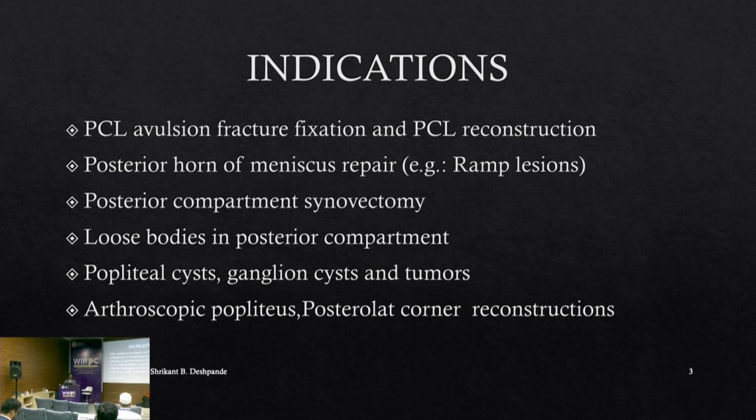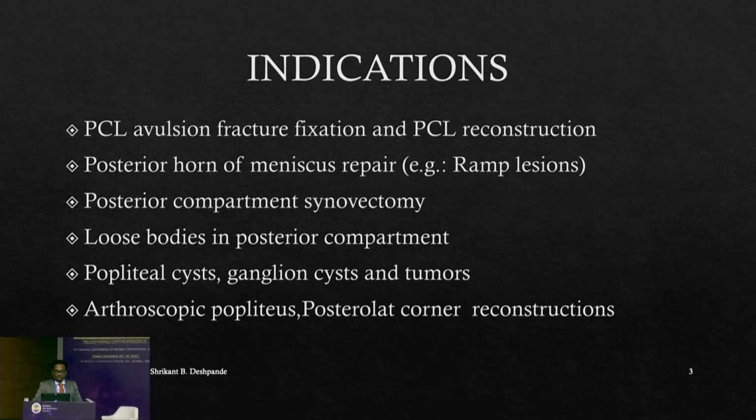The indications for the posterior portals in orthopedics are PCL avulsion fracture and PCL reconstruction, posterior horn of meniscus repair, ramp lesion especially, posterior compartment synovectomy, loose bodies in the posterior compartment, popliteal cyst, ganglion cysts and tumors, and, nowadays coming up, arthroscopic popliteus and posterolateral corner reconstructions.